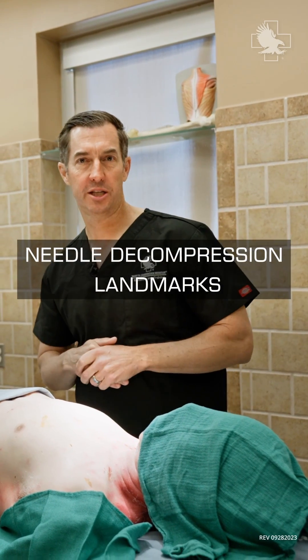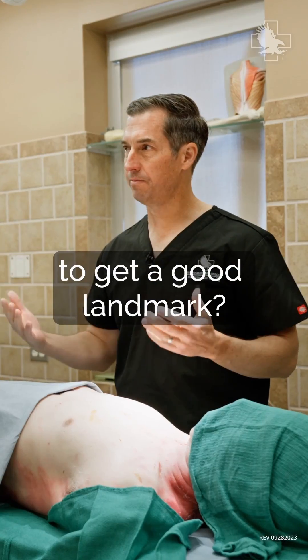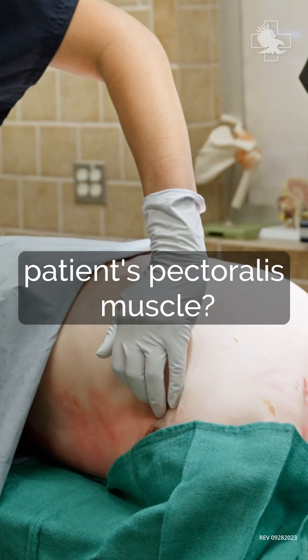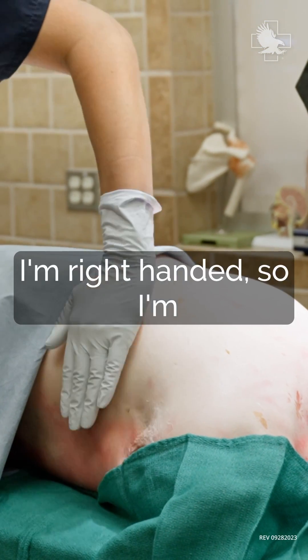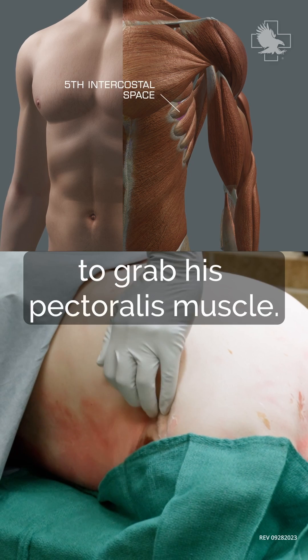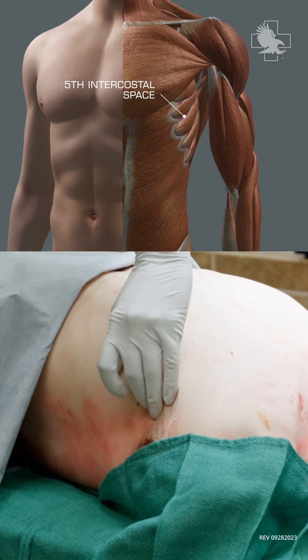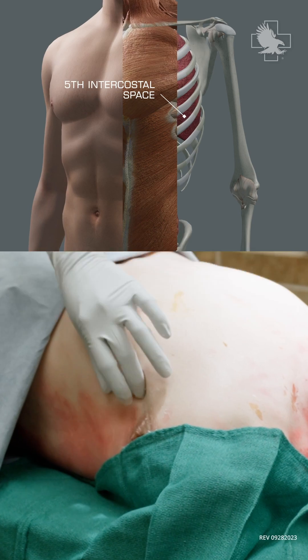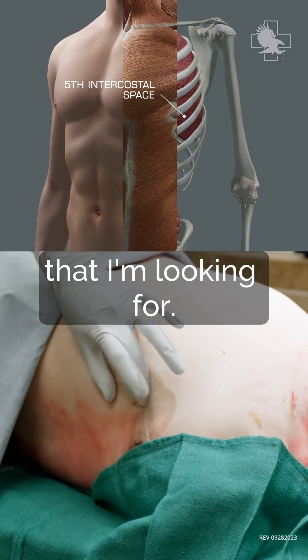We're going over left lateral chest placement. First, I want to identify where the patient's pectoralis muscle is. I'm right-handed, so I'm using my non-dominant hand to grab his pectoralis muscle. My pointer finger finds directly where that rib is — this happens to be the fifth intercostal space that I'm looking for.